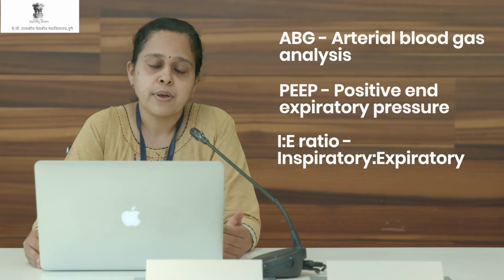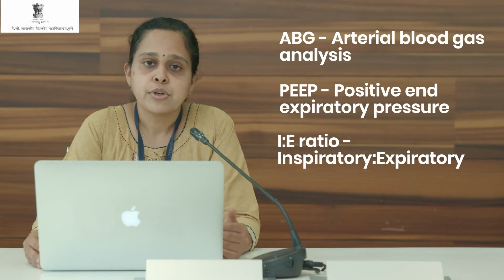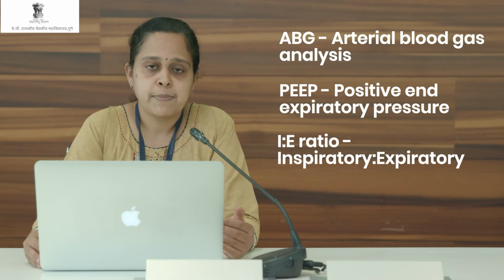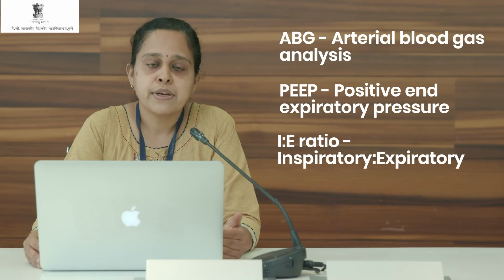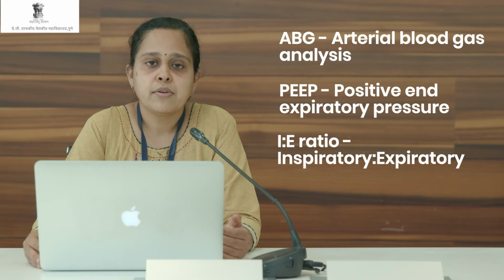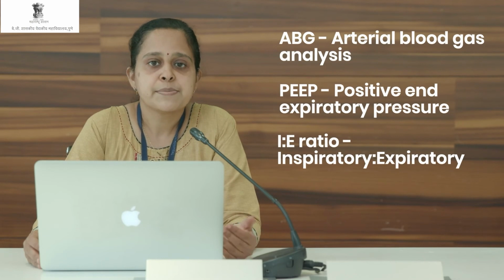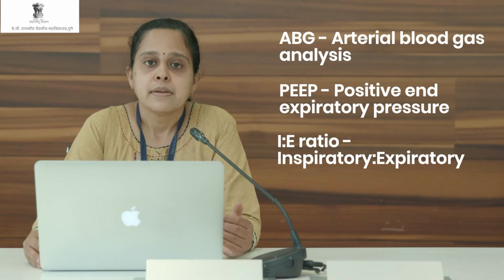Normally the set ratio is 1:1.5 or 1:2. Now this ratio can be altered to 1:1 also, so that the inspiratory time increases and the lung oxygenation is improved.